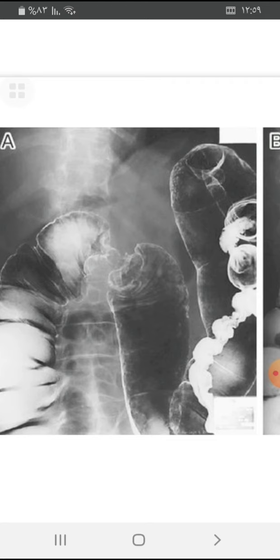The patient should be kept on a semi-solid diet in the first day, a semi-fluid diet on the second day, and on the third day on a fluid diet, do an enema for the patient, and keep the patient fasting overnight. Colonic preparation is important prior to a barium study or prior to CT study of the colon, because the solid content may adhere to the wall, present as a filling defect, and can be misdiagnosed as a carcinoma.